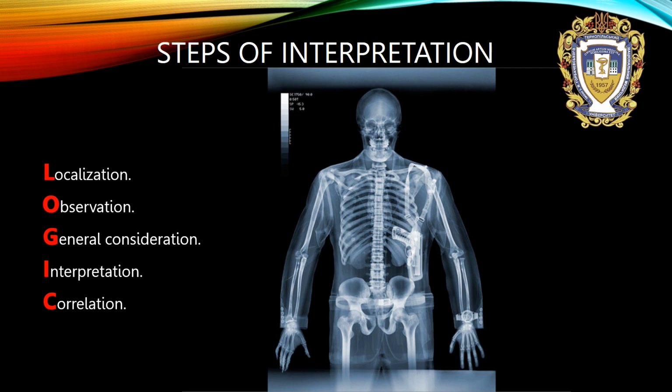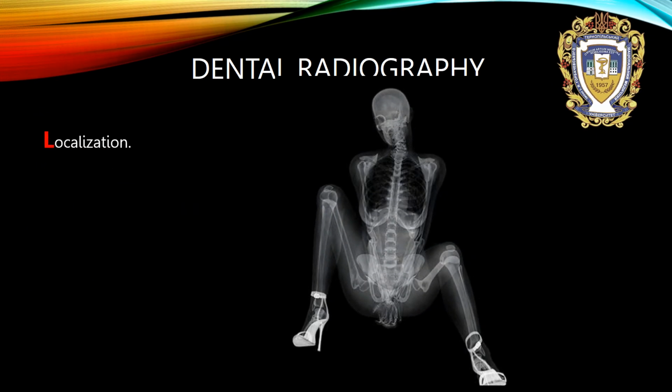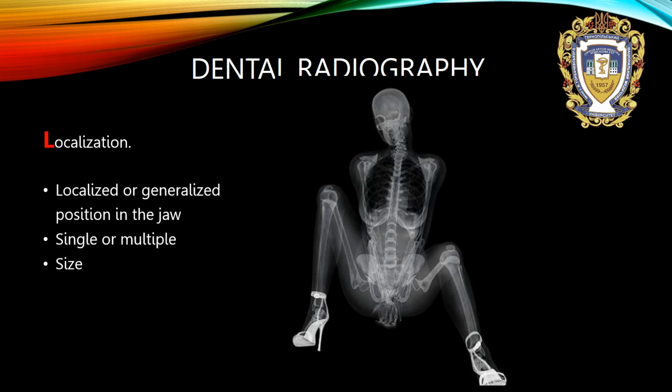During our interpretation of an X-ray, we need to describe every position. Localization. We need to describe whether the problem is localized or generalized, its position in the jaw, single or multiple, and the size of the pathology.